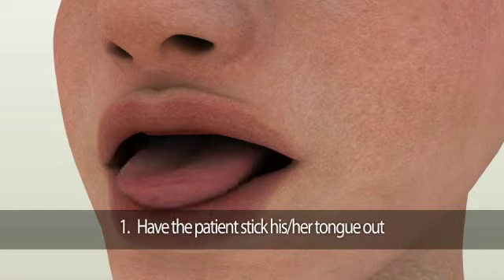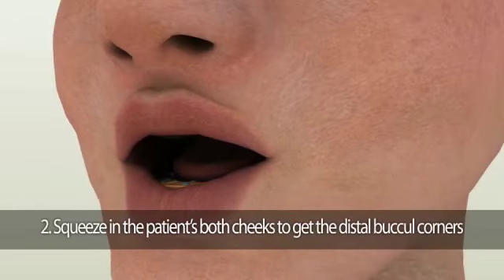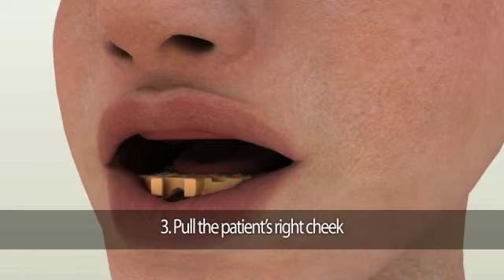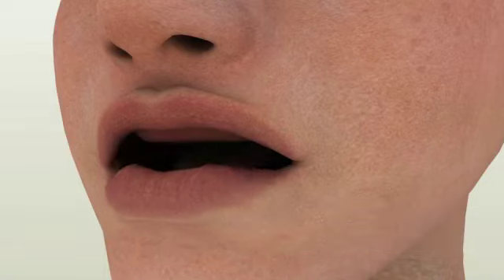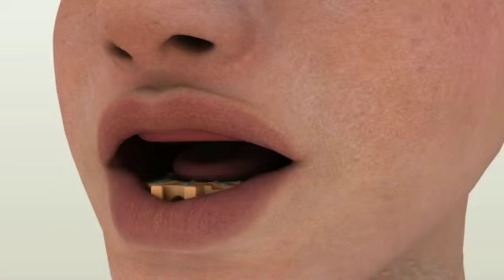First, ask the patient to stick their tongue out and then towards the corners of their mouth. Second, ask the patient to say 'O' to squeeze both cheeks to capture the distal buccal corners while the patient's mouth is completely relaxed. Third, pull the patient's right cheek. Fourth, pull the patient's left cheek. Fifth, gently pull their lower lip upward so the membranous attachments and frenums are activated. Repeat these border molding movements three to four times until the material is set completely. Setting time varies by manufacturer, so check your PVS impression material instructions.